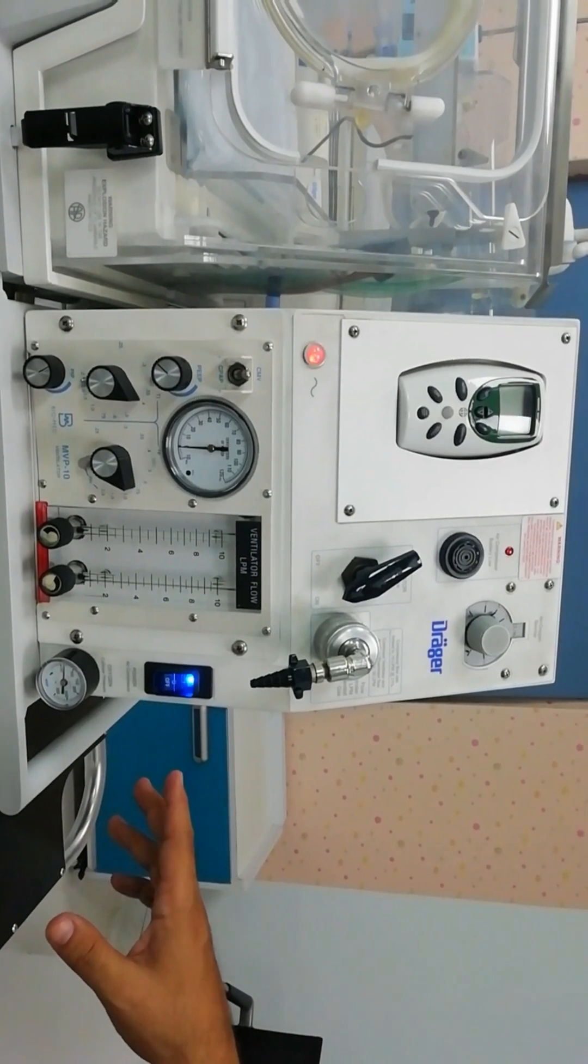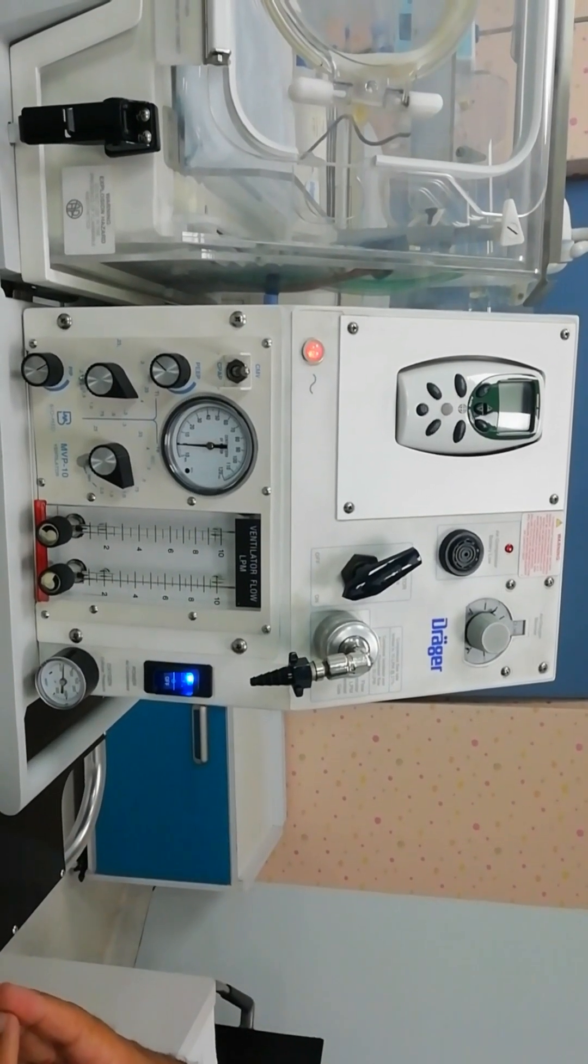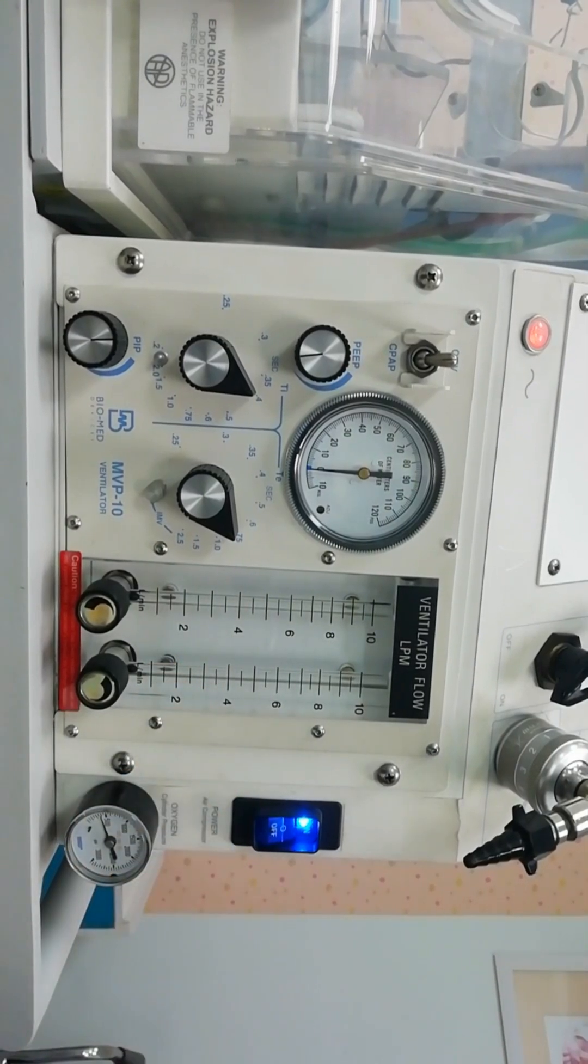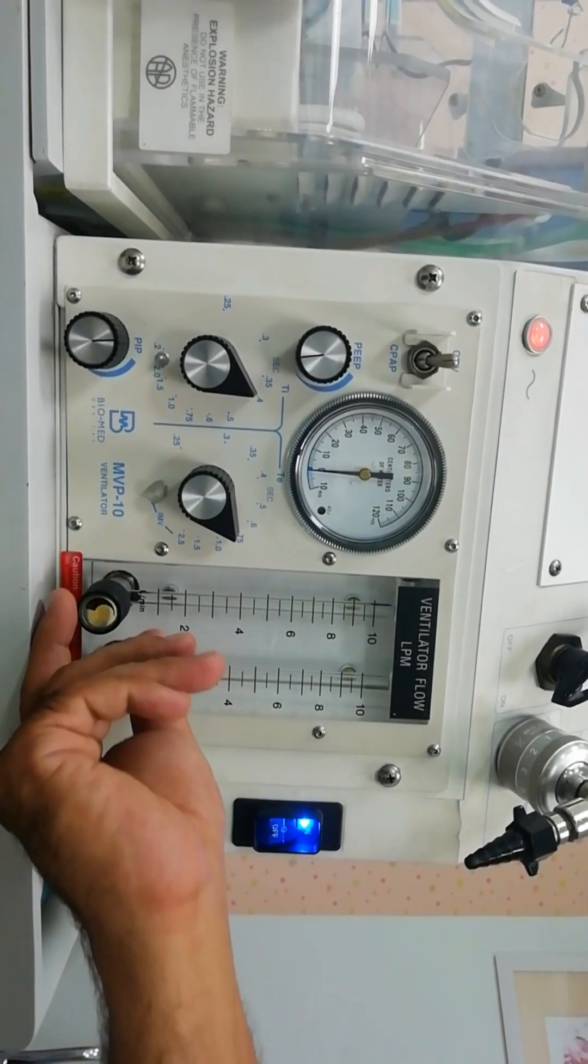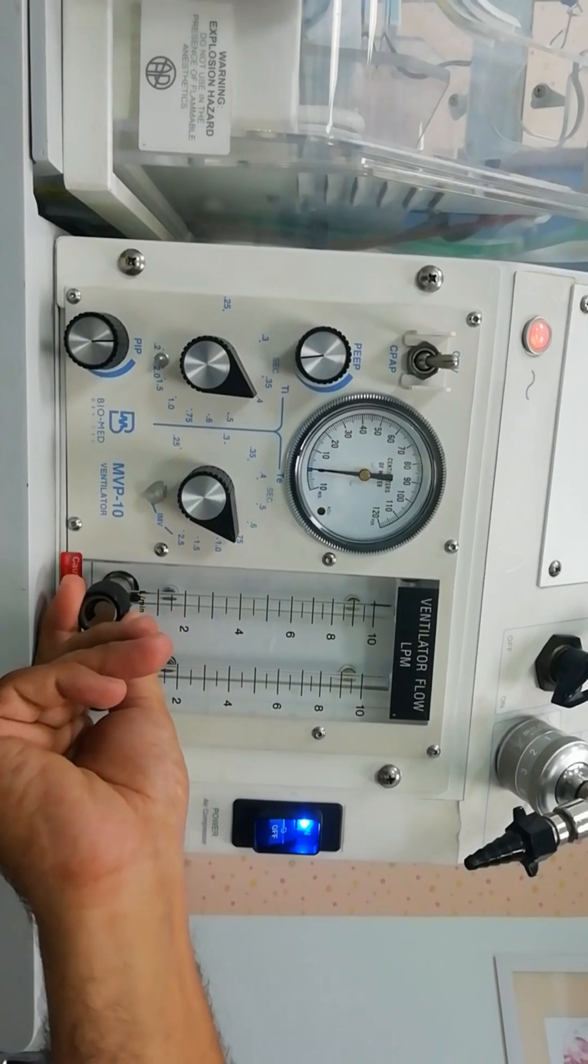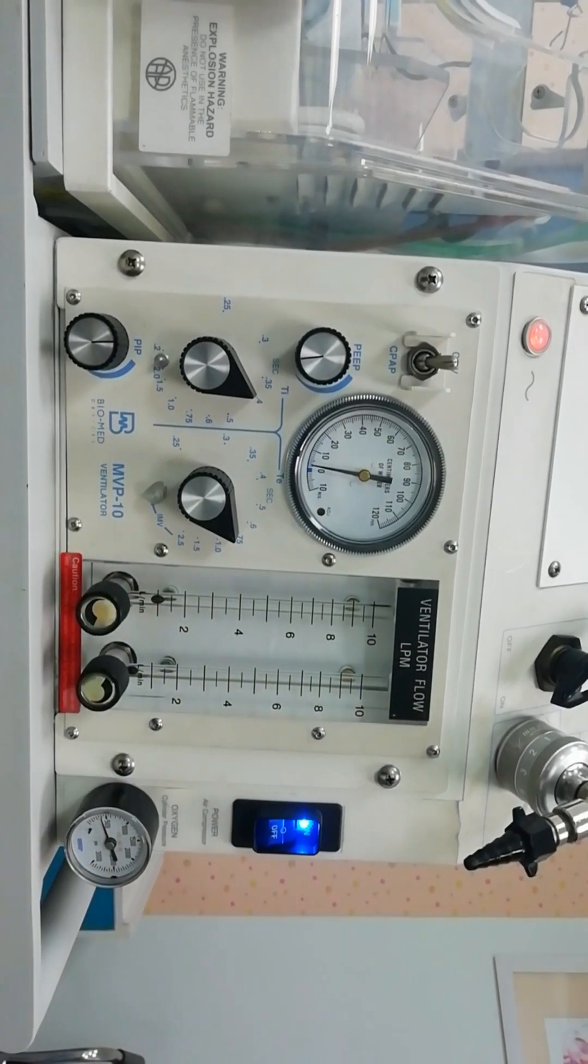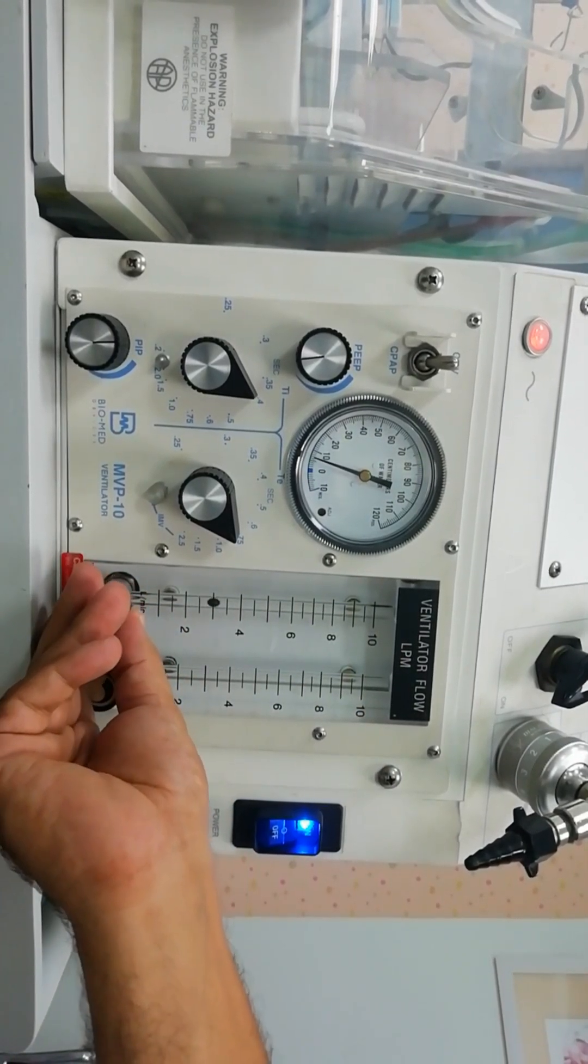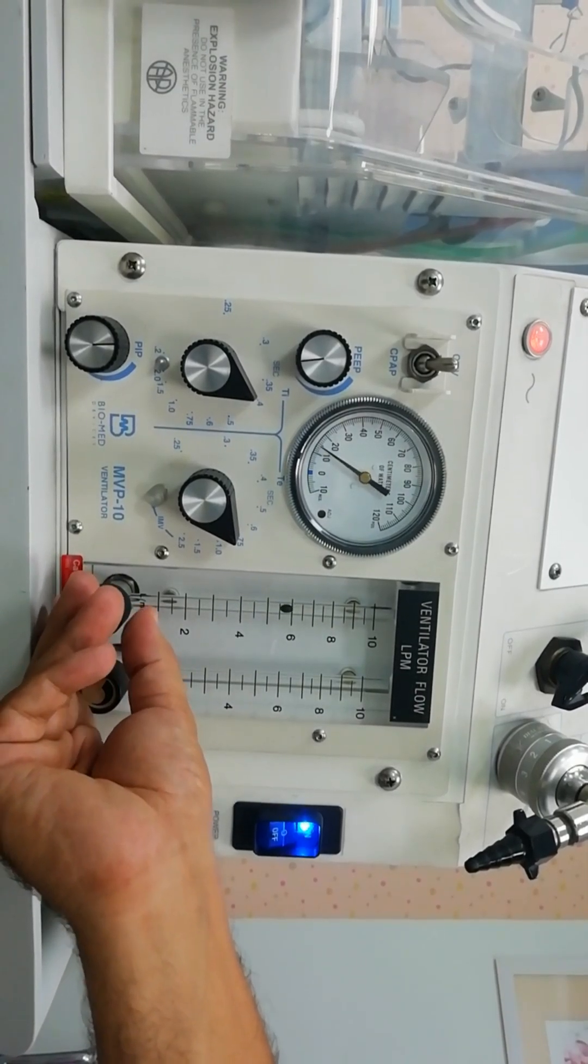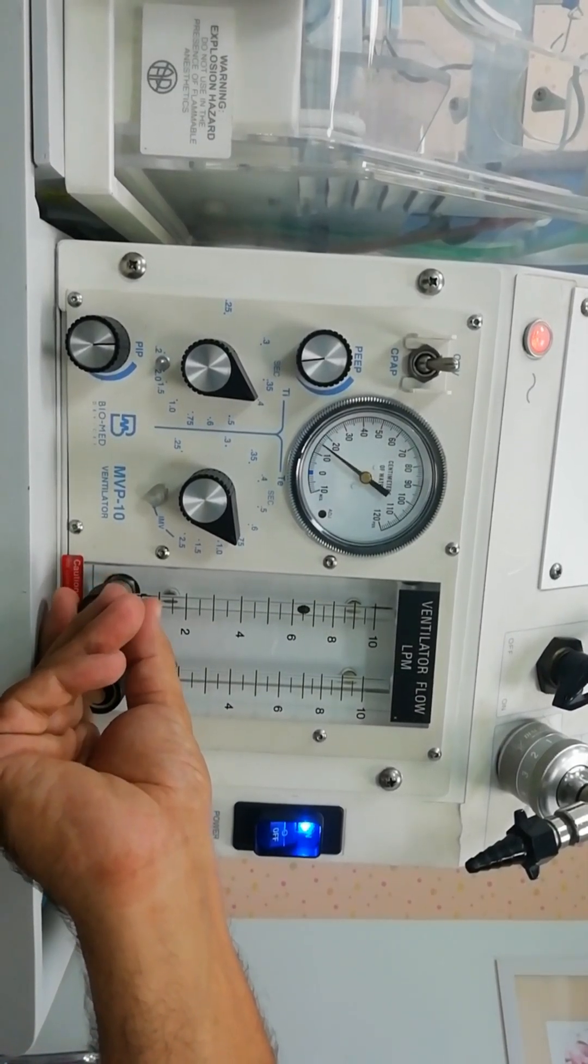The flow meter - we have two meters. Of course we are going to use one of them. Each one would provide us up to 10 liters of flow. We are going to start with six liters and you can increase up to eight depending upon the chest rise of the patient.